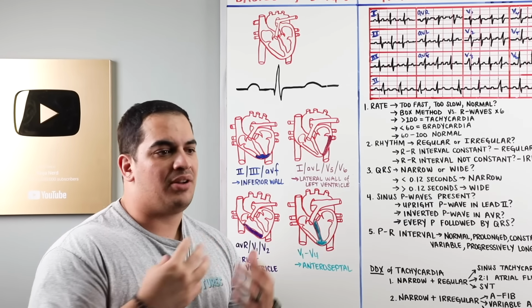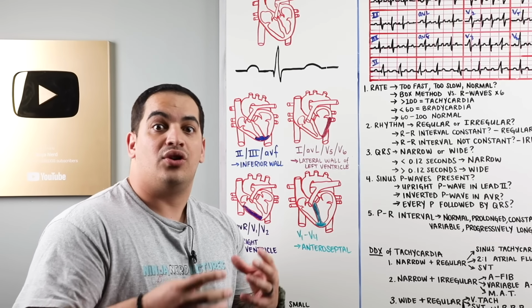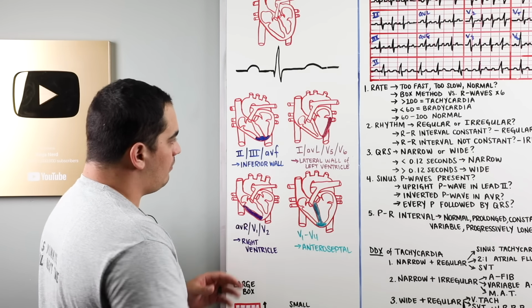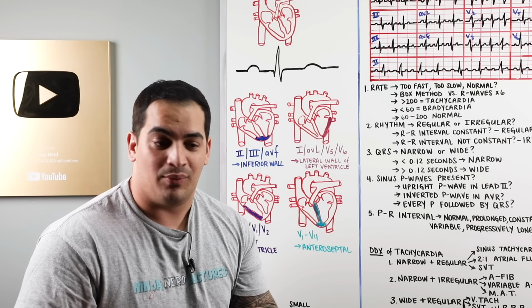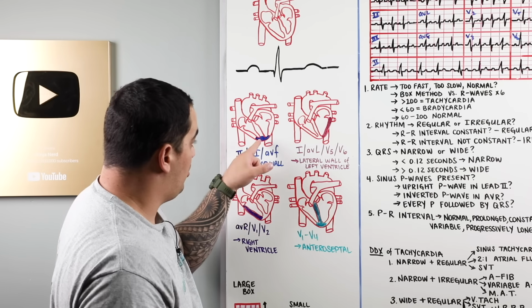And electrodes, there's a bunch of different types, and we use these different things called leads to determine the electrical activity of the heart in different planes. Let's talk about that. So here we have some hearts, and we're going to focus on a particular electrical activity in a very specific portion of the heart, and what leads, which are going to be based upon the electrodes where we put them, tell us about the electrical activity in that portion.